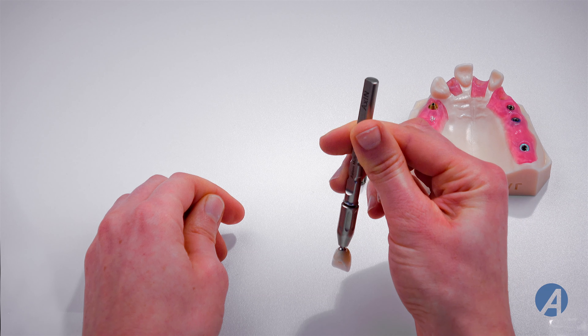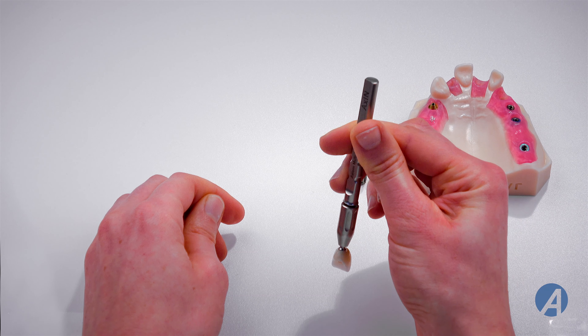Unscrew the ring and remove the axion tooth. The tooth is now ready to be placed in the mouth.